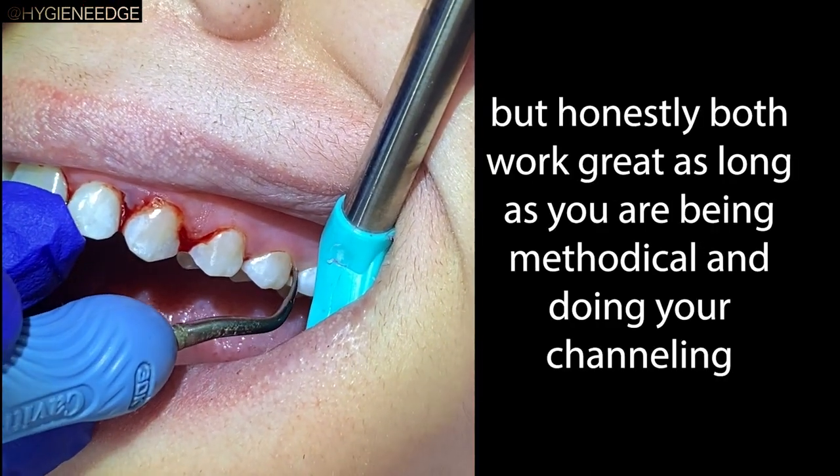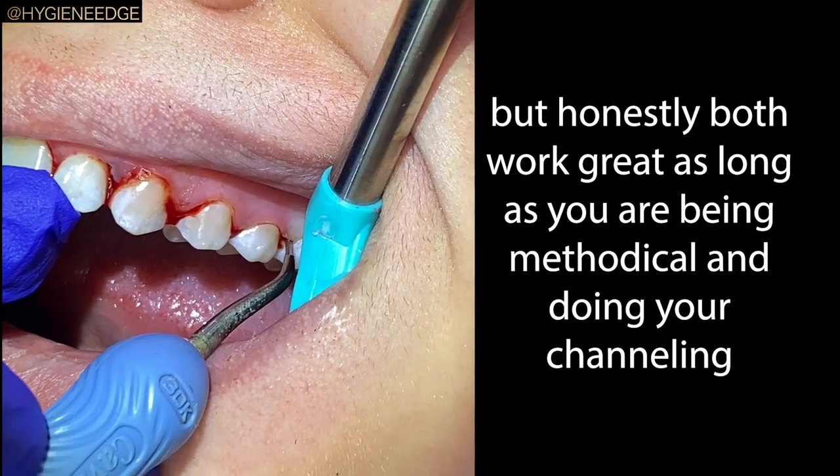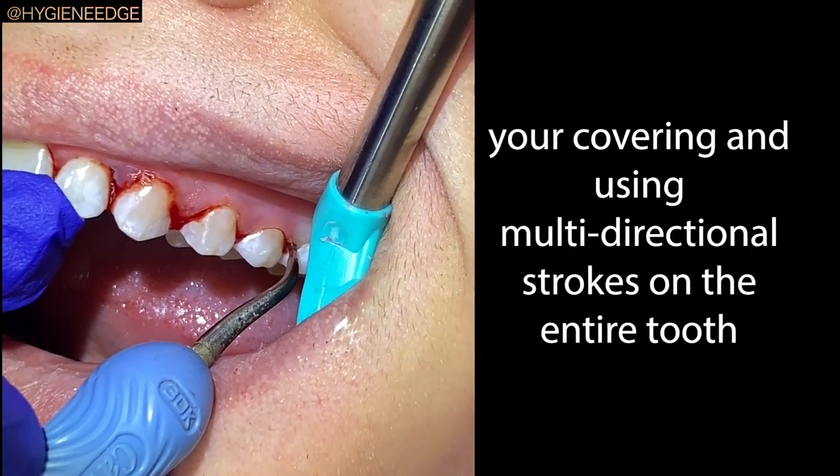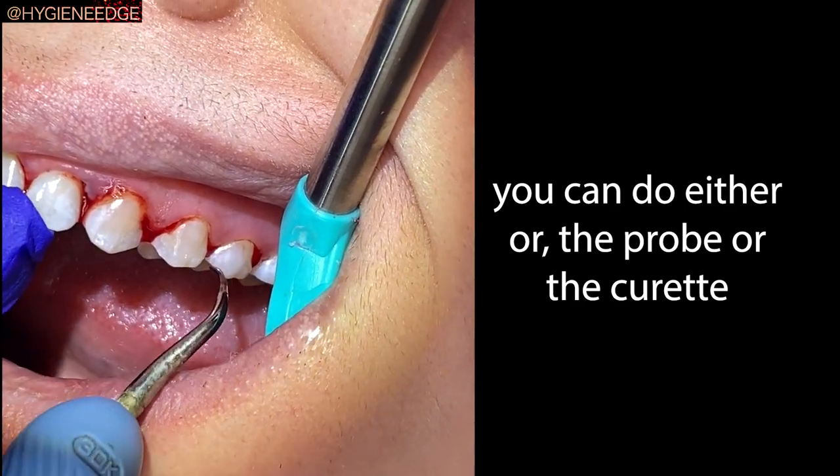Honestly, both work great as long as you're being methodical, you're doing your channeling, and you're covering the entire tooth. You can do either — the probe or the curette.